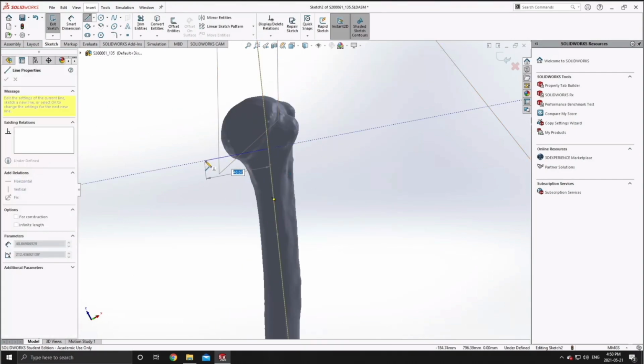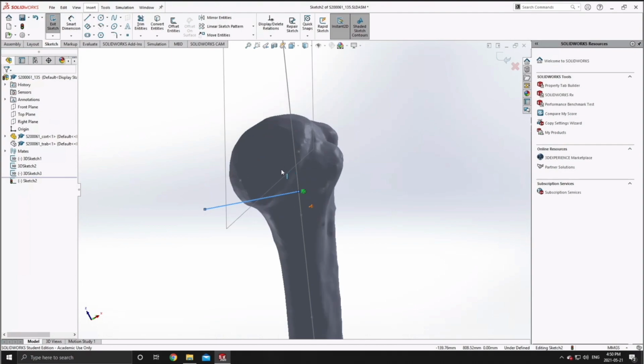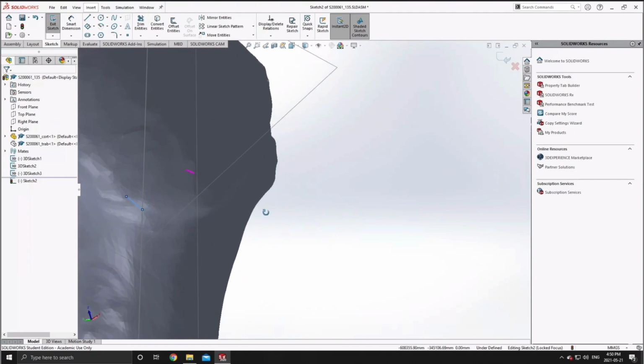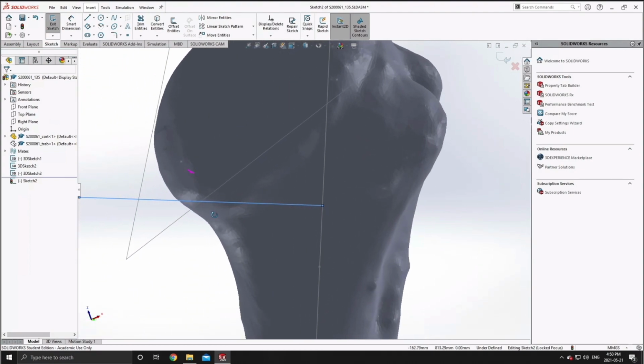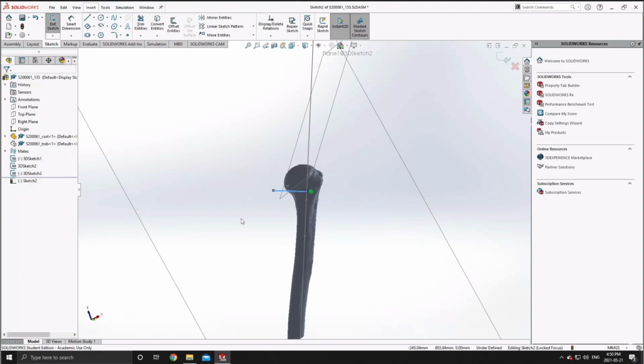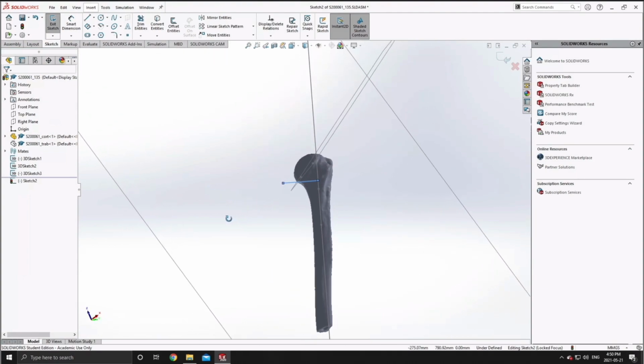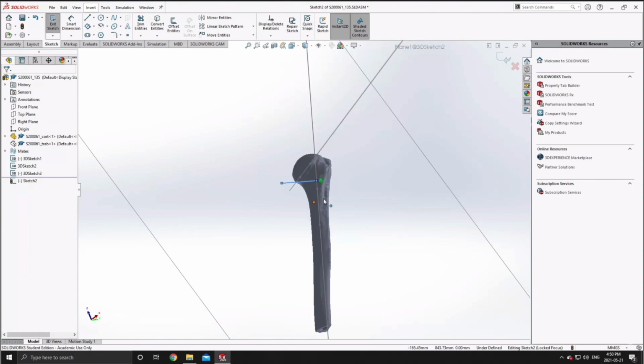So now that we've determined our orthogonal plane, we're going to start by sketching our neck shaft angle as per the surgical guide, choosing our lateralization while referring to the inferior ridge of the humeral head as our guiding bony landmark. For this particular example, I've chosen a neck shaft angle of 135 degrees to match that of our humeral implant.